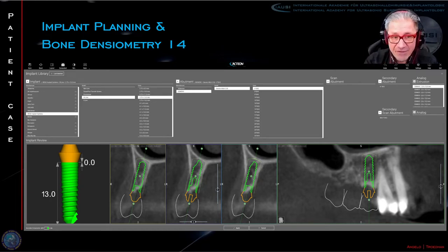On top of the alveolar crest, we simply had 1.2 millimeter alveolar crest width. But in the planning phase, you want to know, where do I insert the implant? So the implants are inserted. The first one in the first premolar region, of course, is quite clear. This can be placed anatomically completely correct.